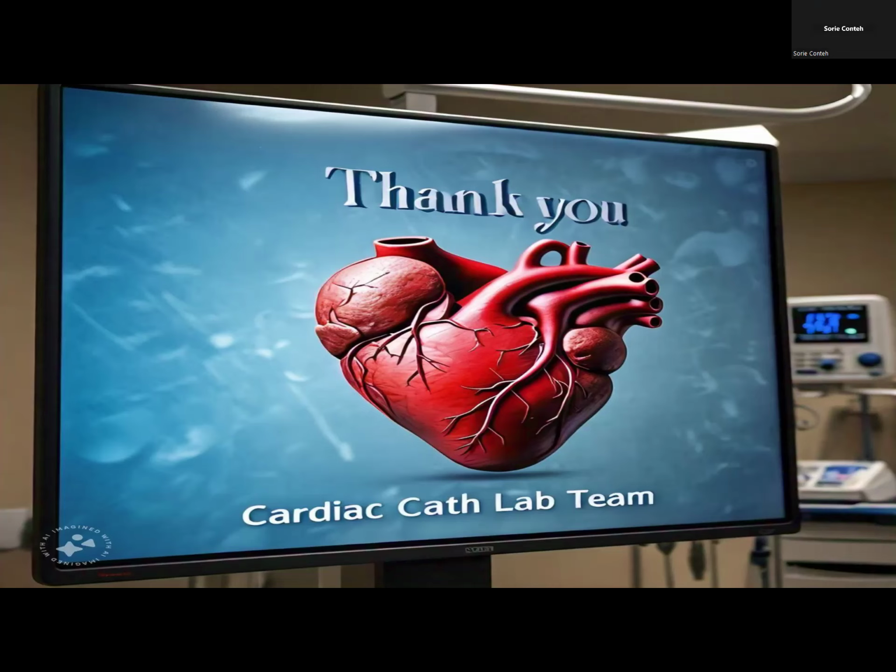Yes, please. Okay, so for the radial access, first you want to do the Allen test, in which case you assess for collateral circulation and adequacy to the hand.